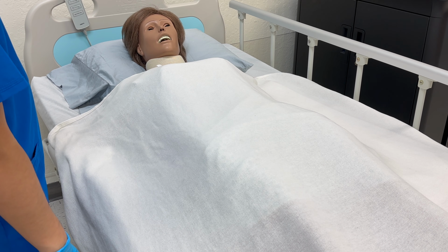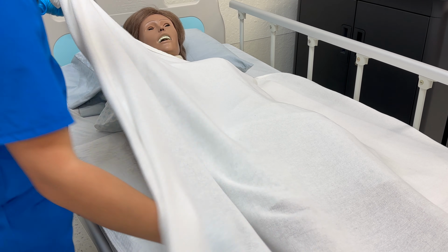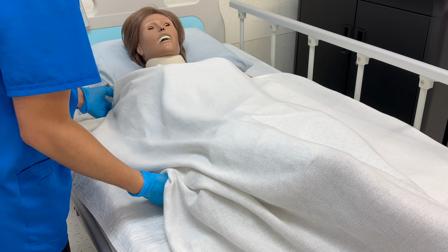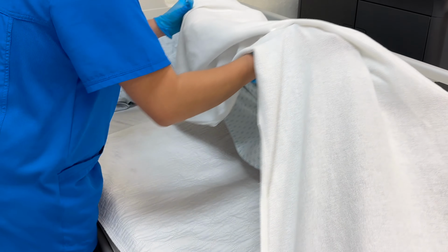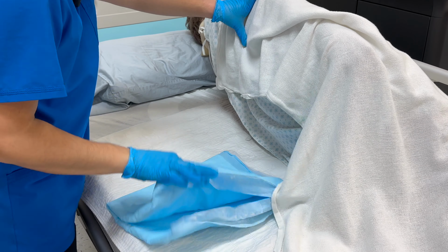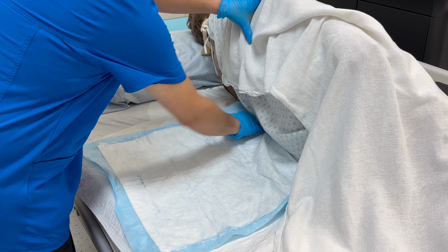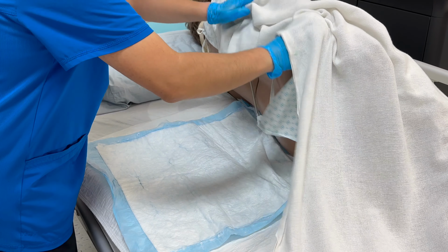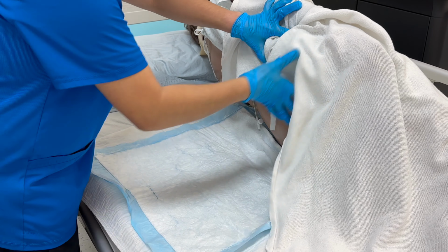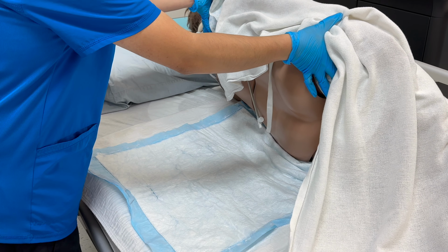Mrs. Smith, I'm going to place the chux underneath you. Please cross your arms and cross your right leg over left leg. On the count of 3, I'm going to turn you to the side. 1, 2, 3. On the count of 3, I'm going to lay you back down. 1, 2, 3.